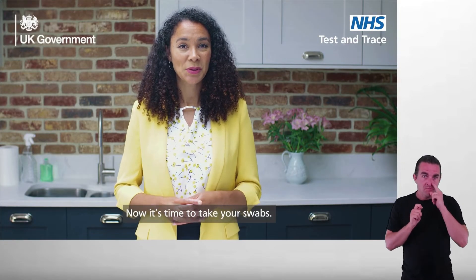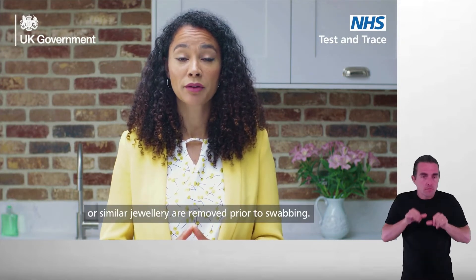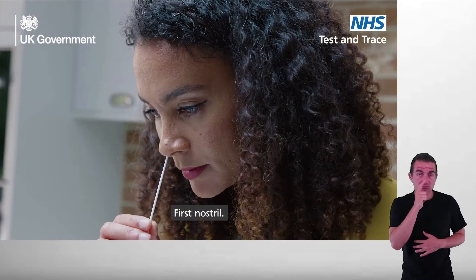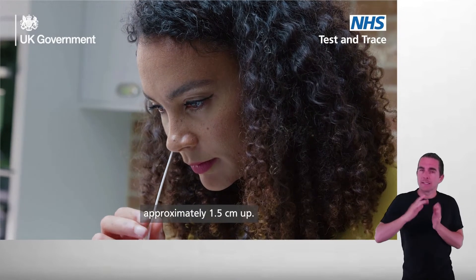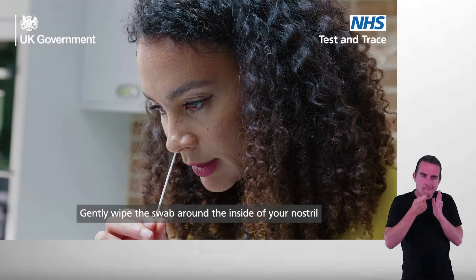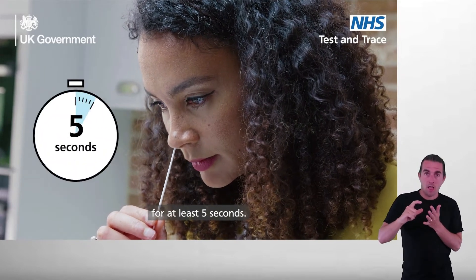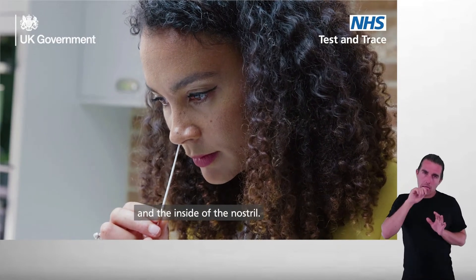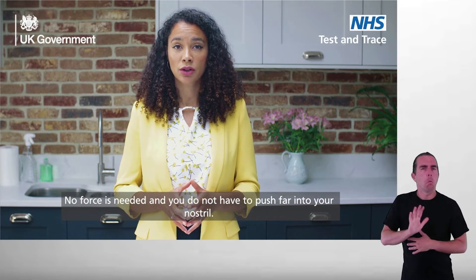Now it's time to take your swabs. Please ensure all nose piercings or similar jewelry are removed prior to swabbing. First nostril: place the fabric tip of the swab just inside one nostril, approximately one and a half centimeters up. Gently wipe the swab around the inside of your nostril in a circular motion five times for at least five seconds. Ensure there's good contact between the fabric tip of the swab and the inside of the nostril. No force is needed and you do not have to push far into your nostril.